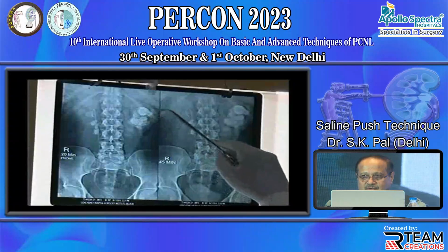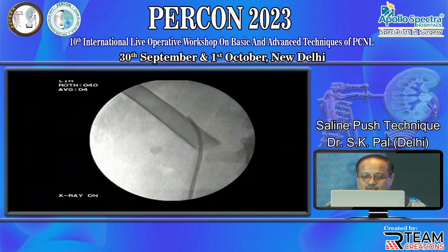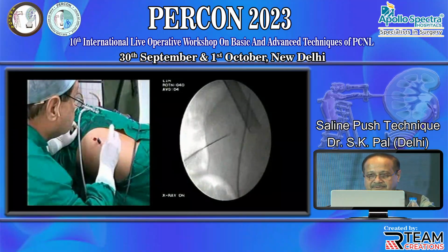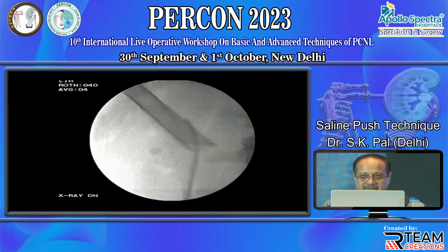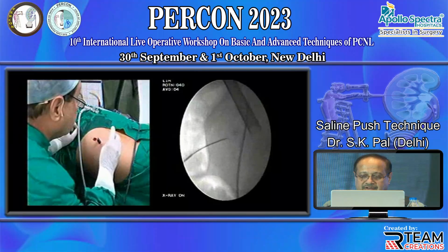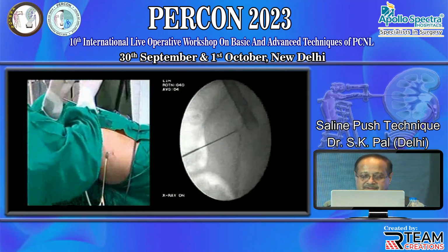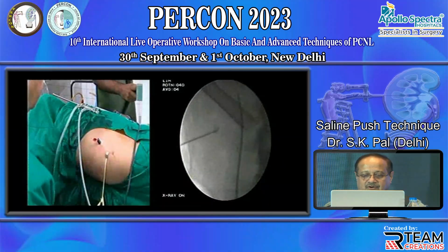So this is how, in this particular scenario, when all stones were removed, this stone was not coming in front. It was difficult to access that. You can directly puncture the stone, guided puncture on the lateral aspect. It is not coming, there is a restricted mobility. So make a puncture, stone guided puncture over there, up to the stone. Check in 0 degree, 30 degree that I am at the lateral border of the stone.